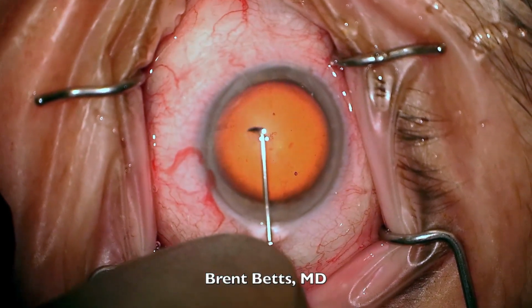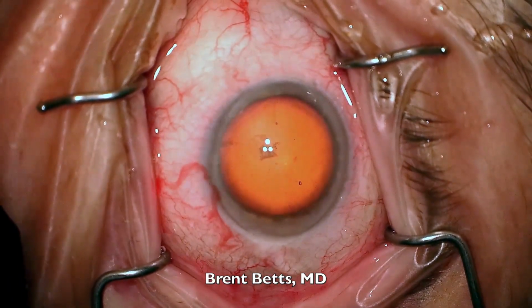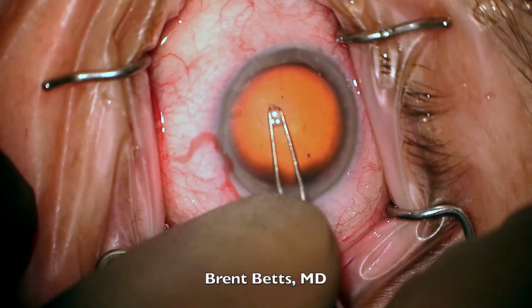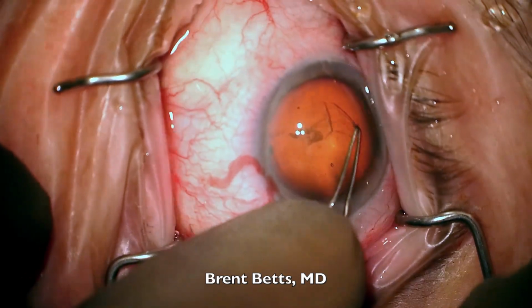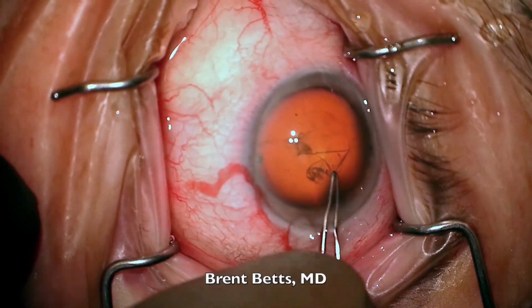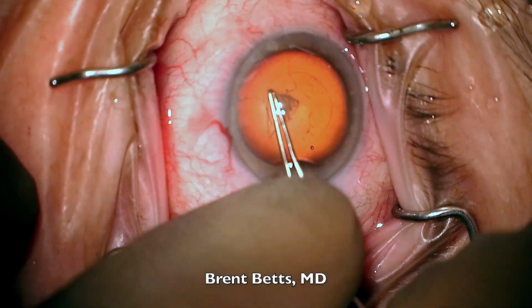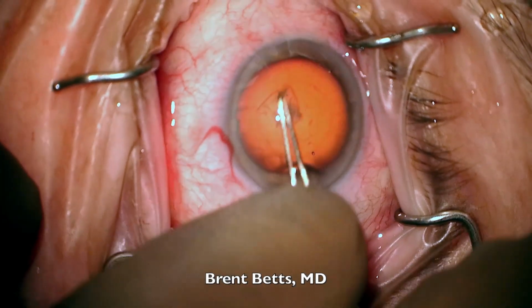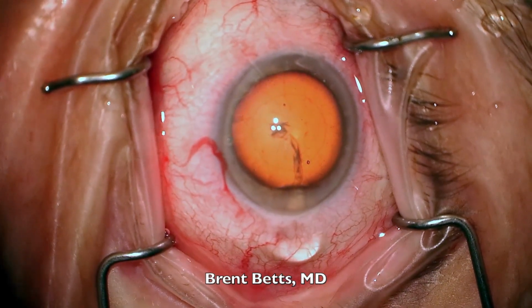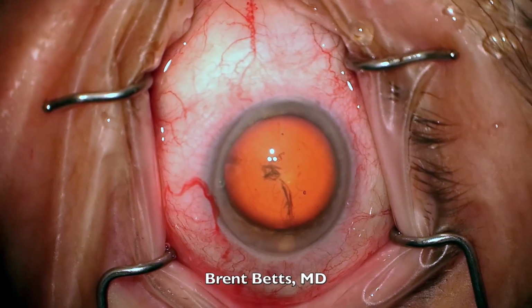I'm using a device called a cystotome to make an opening in the capsular bag, which is the outer layer of the cataract. After this, I introduce a tool called the Utrata forceps, and I grasp the edge of this capsule that I've exposed, and I make a circular motion to make a circular opening in the capsular bag. We call this a capsulorhexis. We found that the circle is the strongest shape in regards to tension, and so you want to make this as round as possible.